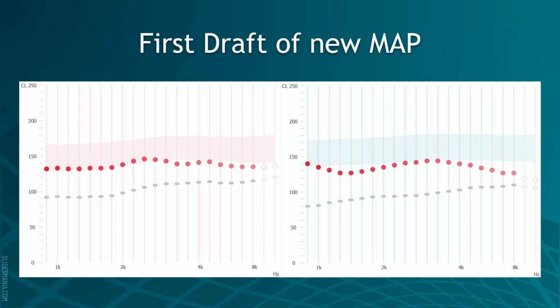All the rest of the electrodes had a dynamic range of at least 20, 22, which is not perfectly ideal, but it is enough that you can get some resolution to the auditory input coming from those electrodes. So now we have electrodes 22 through 3 on both sides.